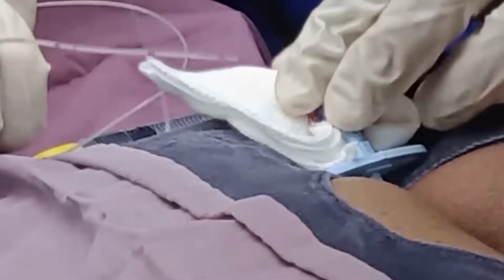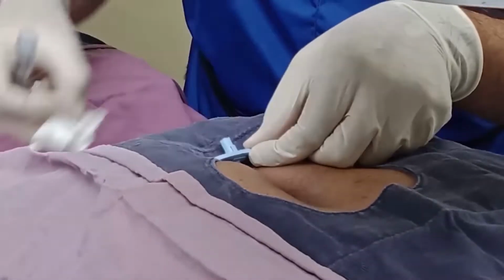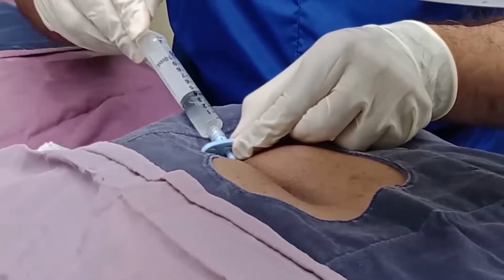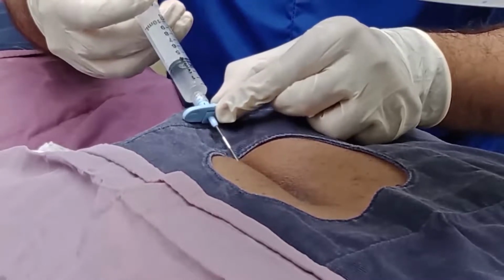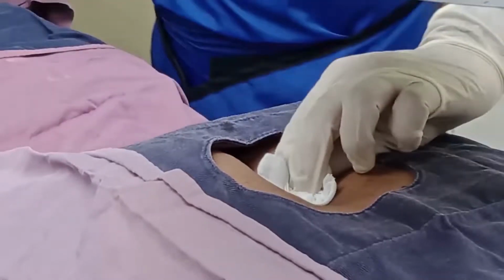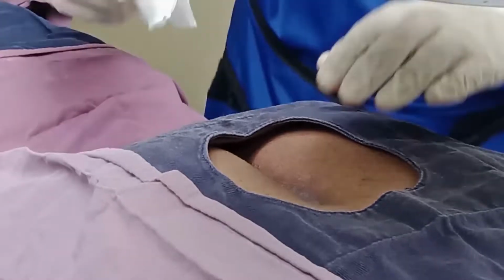The blue tip of the epidural catheter is checked to ensure that it is intact, so that there is no shearing off of the catheter. Local anesthetic is injected through the epidural needle while it is being pulled out. Compress the area with a sterile swab so that there is no bleeding, and then a sterile dressing is done on that area.